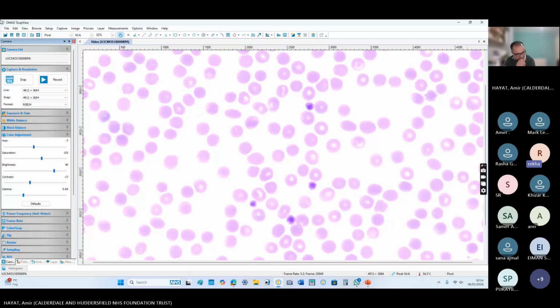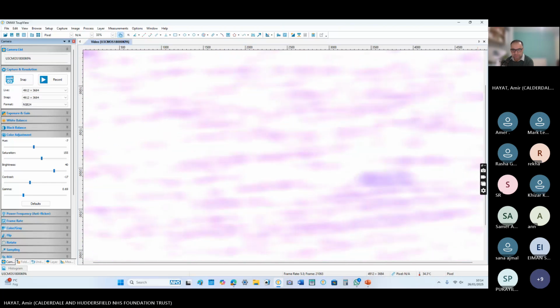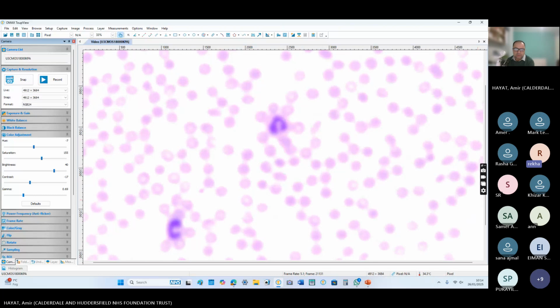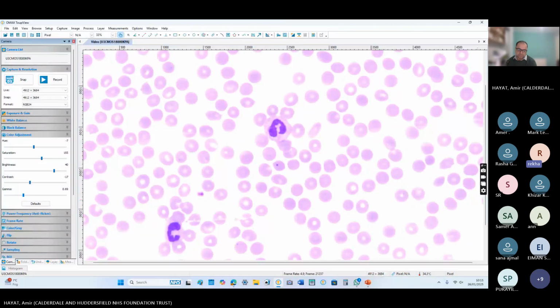Okay. So the blood film is showing marked thrombocytopenia with platelet anisocytosis. There is a leukopenia. There are very few neutrophils in this patient. The red cell morphology is showing normocytic, normochromic cells. So the findings are suggestive of thrombocytopenia. That could be immune related, viral induced, or drug induced; I need more detail in the history.